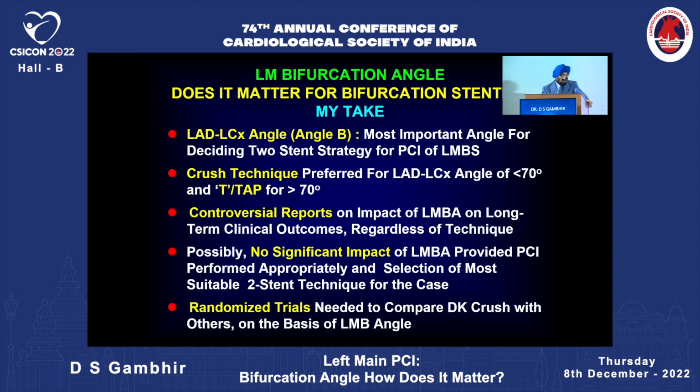But there are controversial reports on the impact of left main bifurcation angle on long-term clinical outcomes regardless of the technique. Possibly, I feel there is no significant impact of left main bifurcation angle provided PCI is performed appropriately and selection of a more suitable two-stent technique is carried out for the case in question. However, we need randomized trials to compare DK crush with others on the basis of left main bifurcation angle.